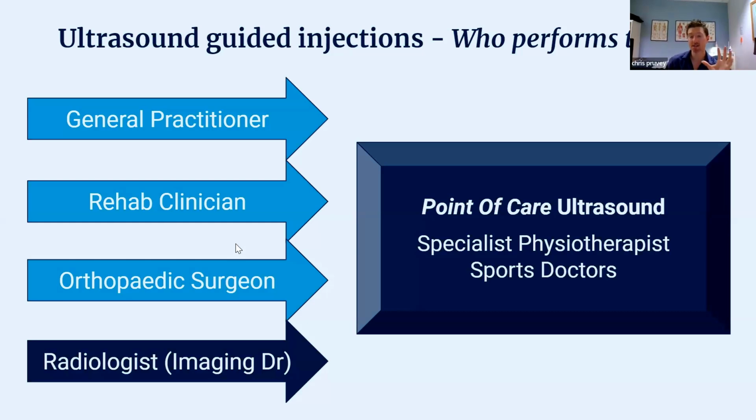So the machines and the technology have got better. We understand that it's probably better for some cases because it shows superficial structures and certain structures in clearer detail, and injections for obvious reasons are being done more and more with ultrasound guidance.